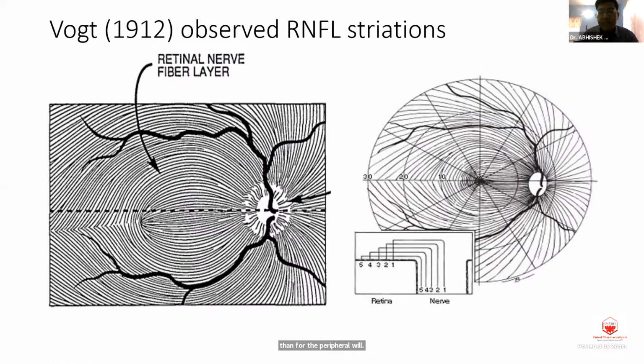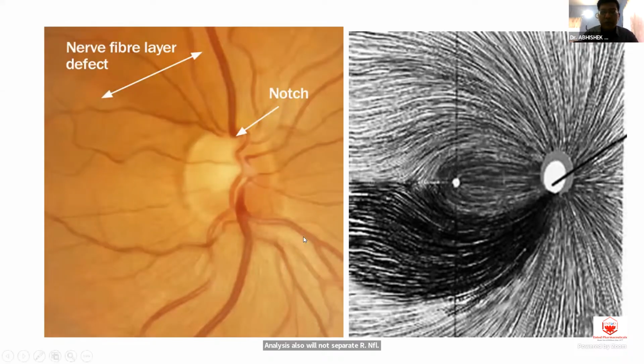This is central to understanding the retinal nerve fiber layer analysis also. We cannot separate RNFL from the fields. They go hand in hand. When a postgraduate looks through his direct ophthalmoscope or a 90D, 78D, this is one thing that they should be looking at. This is an art which has gone missing, I used to say, of late. Just as if you ask a medicine graduate whether they know how to palpate a spleen or liver or kidney nowadays, rather than going for ultrasonography, we are just missing this art. We just go for OCT basically after the perimetry part. But this is something which is very visible and which can be picked up. But this is difficult, obviously.